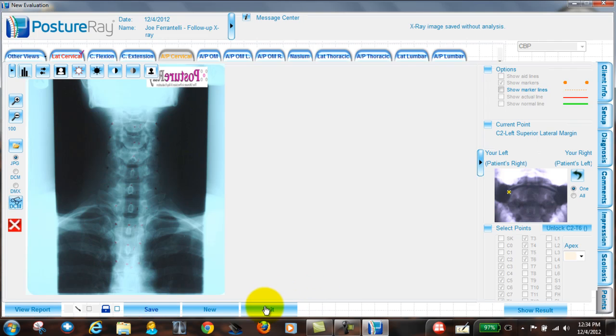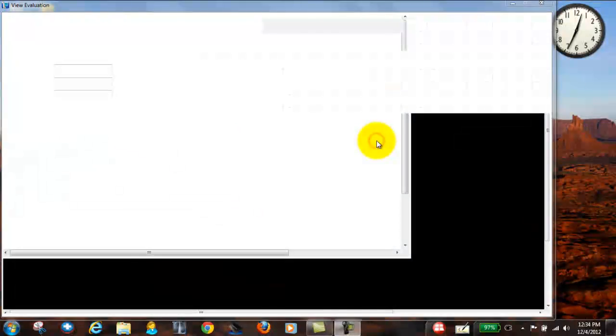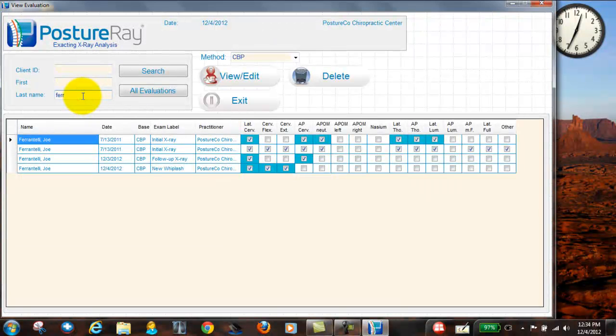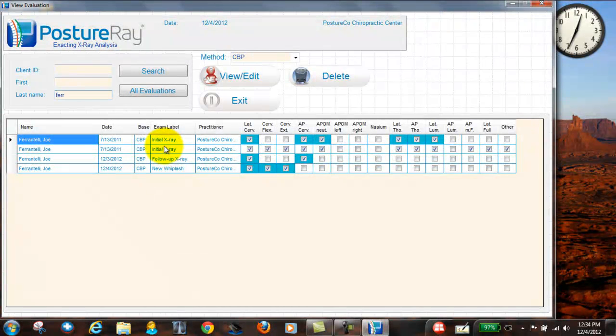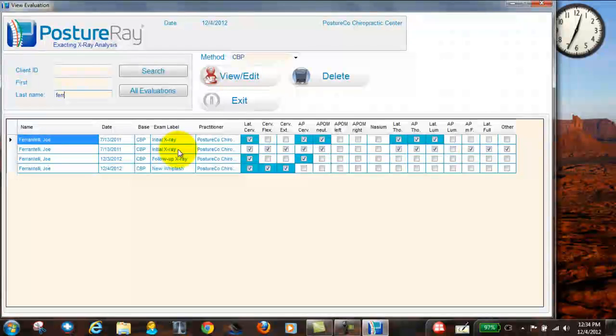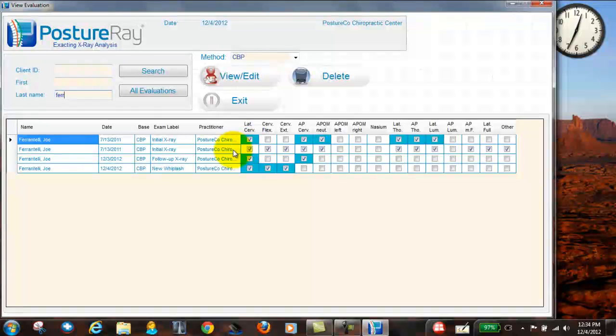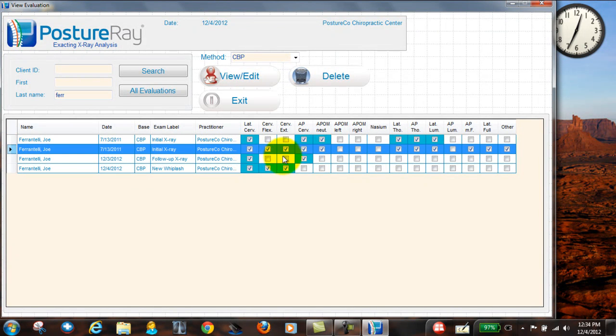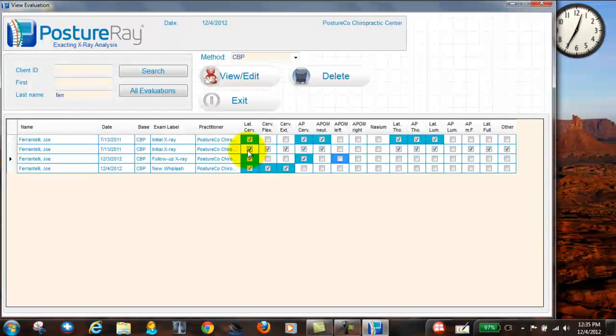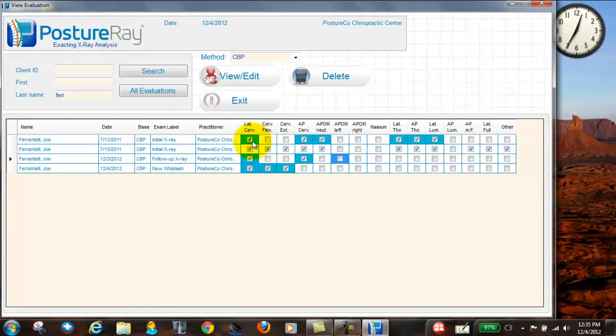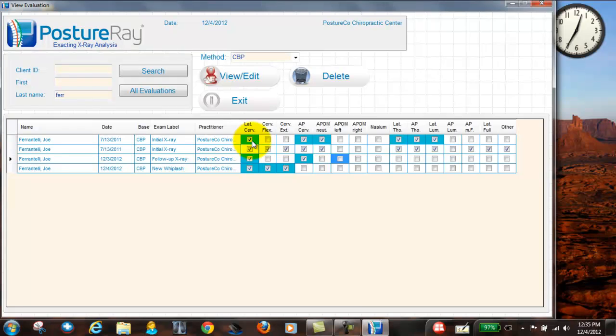And again, if we wanted to check where we're at, if we just hit view evaluation, and let's just narrow this down so that way you can see. Ferrantelli, when I look at this, we have initial X-rays. We have follow-up whiplash. Notice that when we look at this view evaluation, if I look at this data service, notice that there's no blue boxes. That means they're loaded and digitized, where when they have a blue box around it, it shows you that they still need to be digitized. And we'll show you that in subsequent trainings.